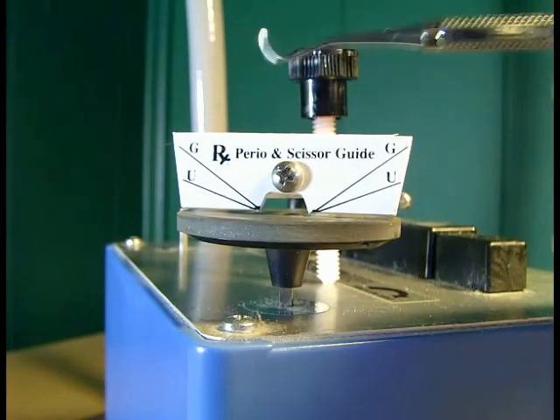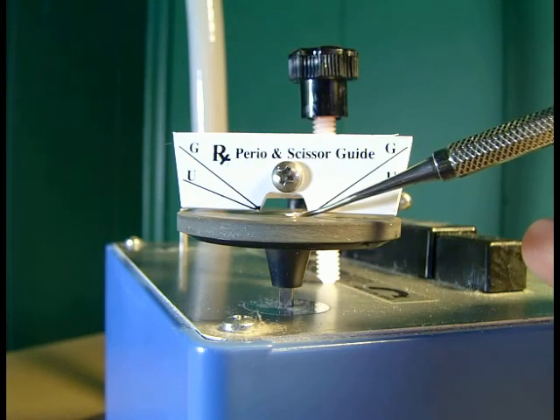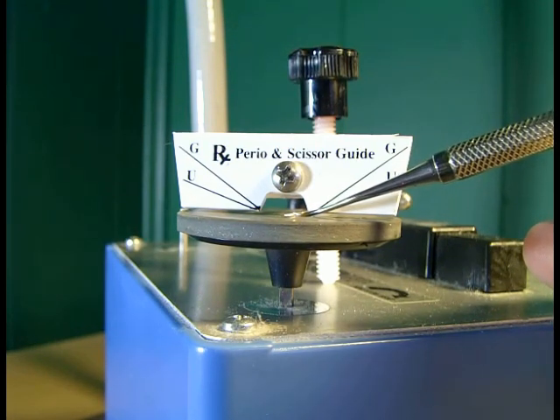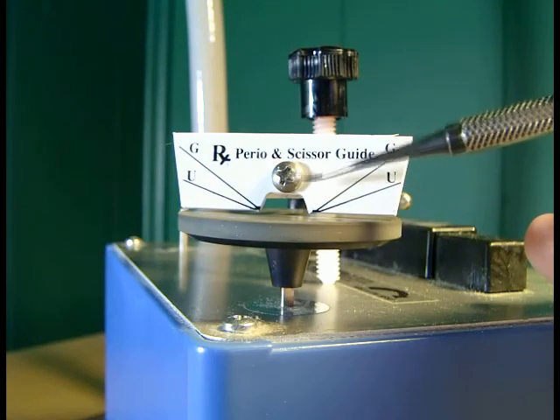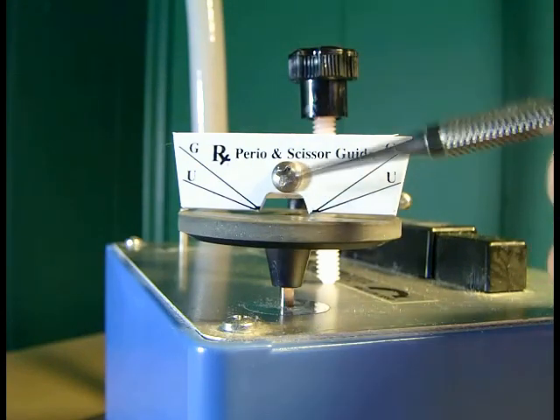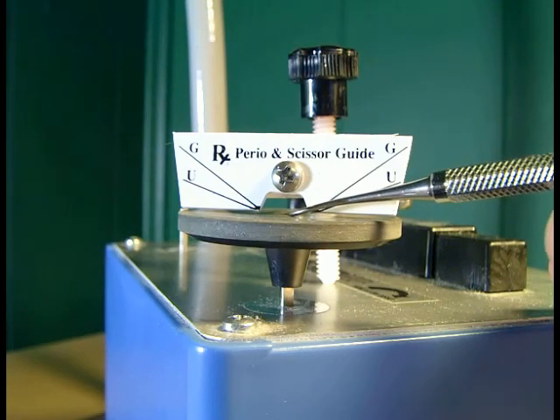Now that you are familiar with the tools and the process, we are going to demonstrate sharpening a universal scaler. Notice how the terminal shank is lined up to the U line. We turn the machine on with our foot pedal and rock it from heel to toe. We then turn the instrument over and do the exact same thing going the other way.